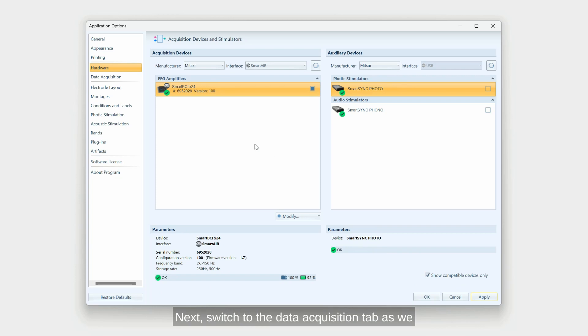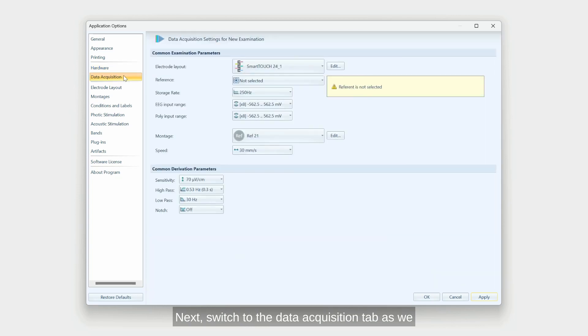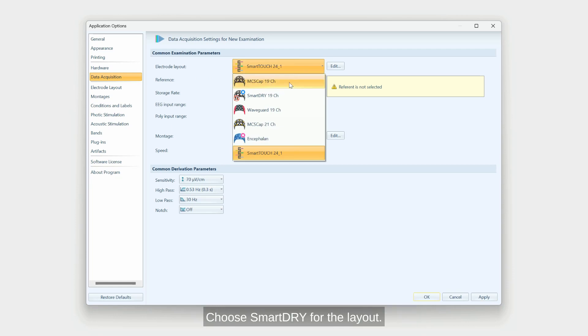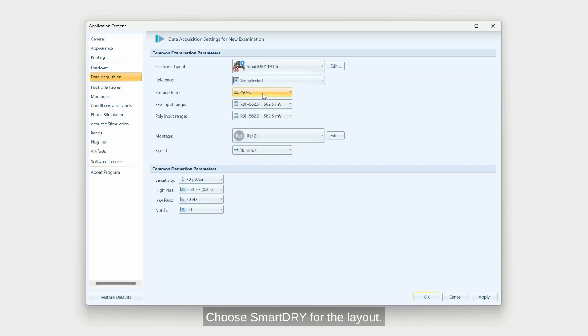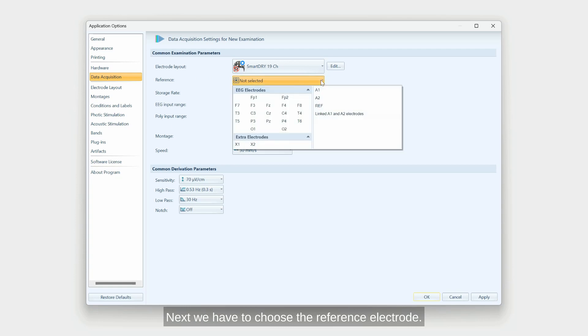Next switch to the data acquisition tab. As we are going to record with our active dry electrodes, choose SmartDry for the layout. Next, we have to choose the reference electrode. I will go for the common ref electrode.